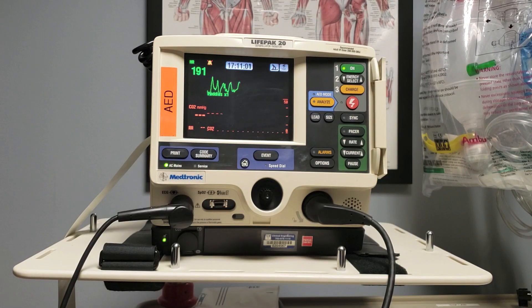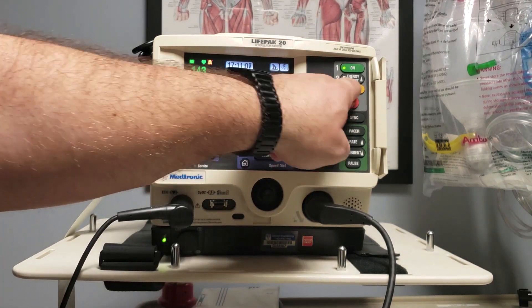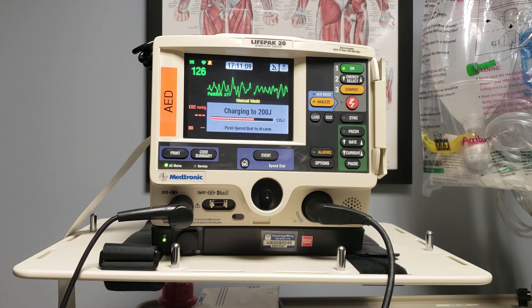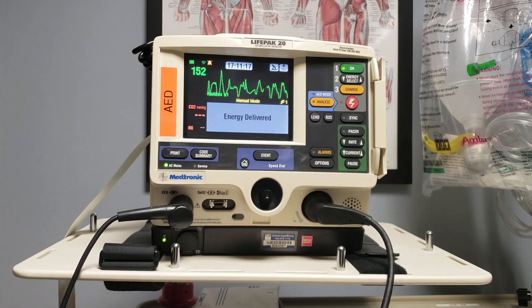I see the patient is in V-fib — we need to shock. Charging to 200 joules. I'm clear, you're clear, we're all clear. Energy delivered.